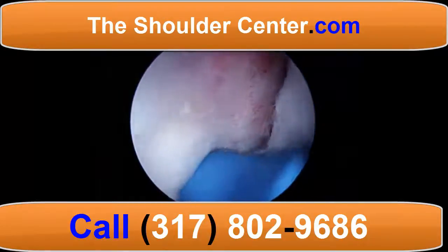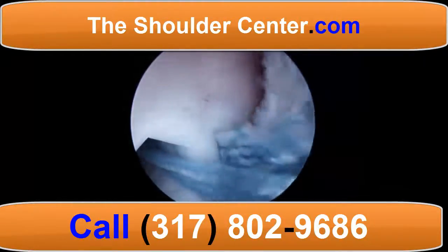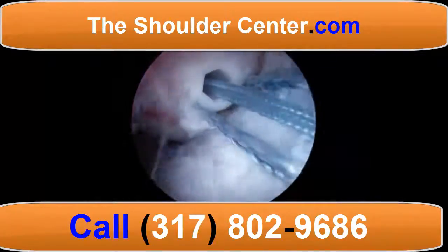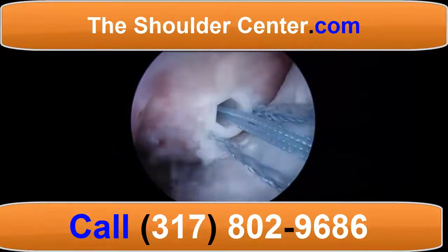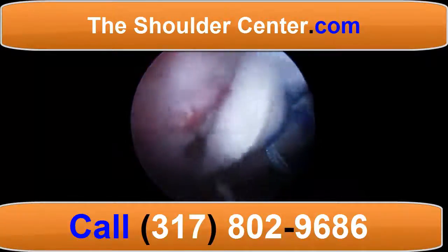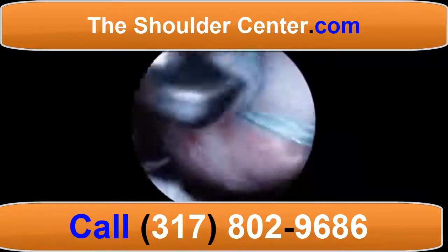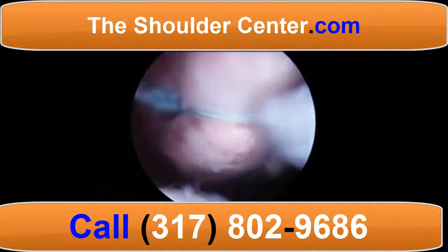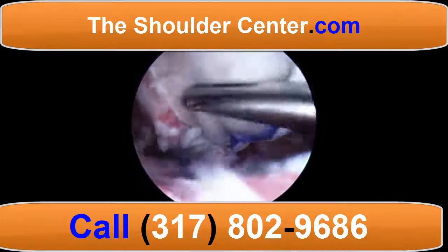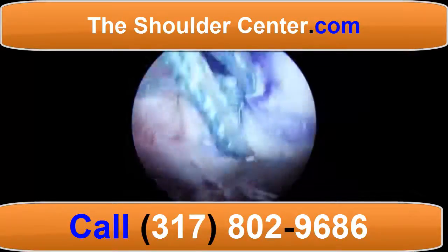These sutures are shuttled through the graft in the appropriate position. We utilize the sliding sutures to fix the position of the graft and then use these to repair the rotator cuff up to its anatomic position to the graft. Side-to-side sutures are also used to repair the rotator cuff to the posterior aspect of the graft.